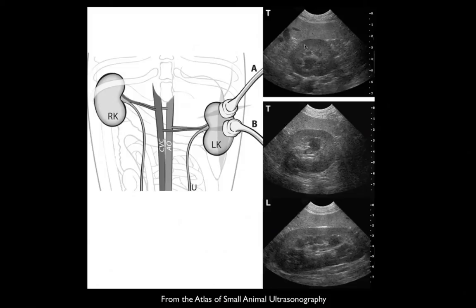The renal cortex can be seen hyperechoic to the adjacent medulla. The urine in the pelvis is barely seen on this image. Fat is noted at the hilus around the renal vessels, and on the longitudinal scan, the contrast between the cortex and medulla can well be seen.